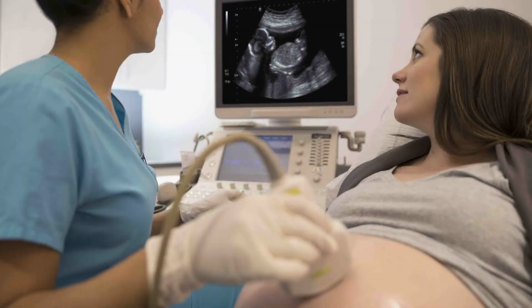Also remember, with ultrasound there's no radiation, and there's no injection, unlike MRI, where you have to have the IV gadolinium. Some patients can't have MRI if they have renal disease or certain medical conditions, if they have a pacemaker, or if they have claustrophobia. But with ultrasound, it's very safe. We use it in pregnant women to look at babies. So it's a great supplemental exam to mammogram for women with dense breast tissue.